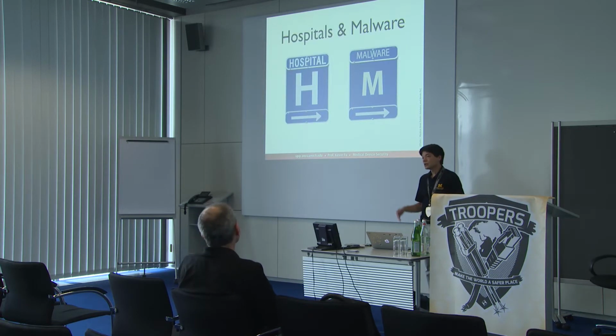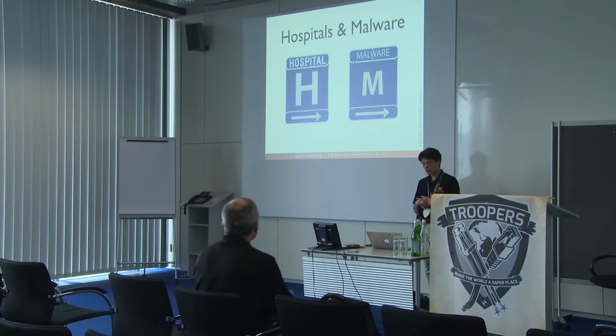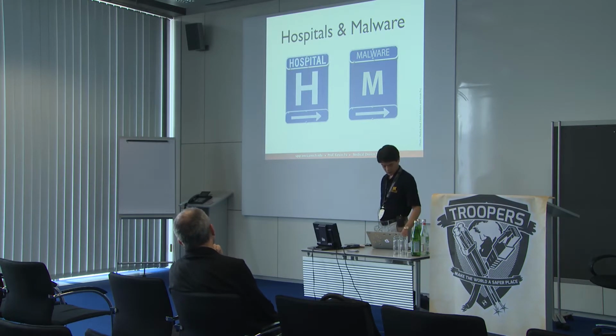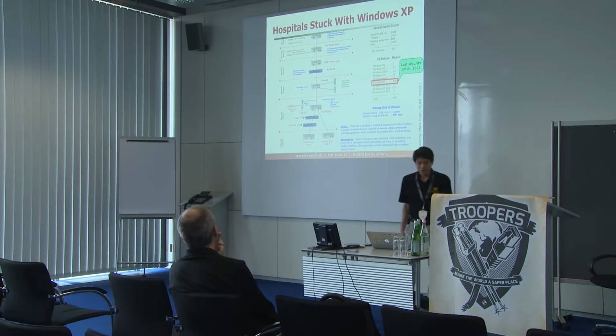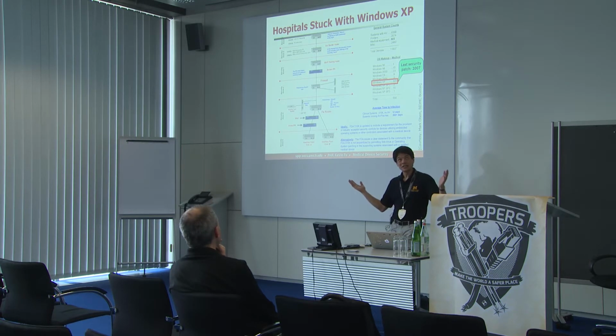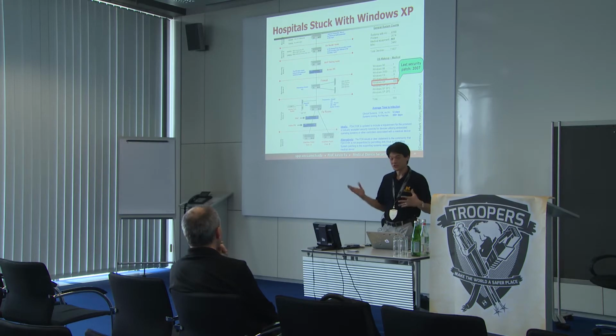But anyhow, yeah, it's not too hard to find security problems with medical devices, but I think it's important to do so because otherwise it's hard to visualize what could potentially go wrong. But if you want to find malware, just go to a hospital. So here's an architecture of one hospital, and I'm not going to pick on this hospital. This is just one hospital, and every hospital is basically suffering these kinds of problems.